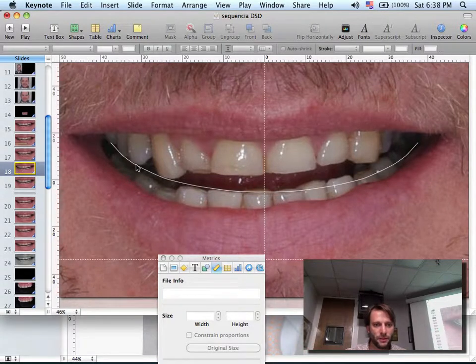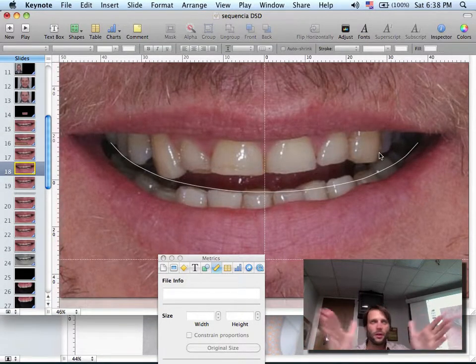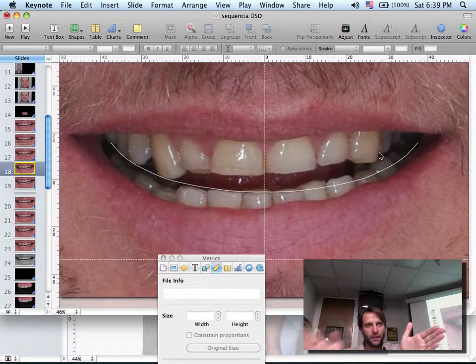So I will see the relation between the line, and I will guide my bicuspids and molars. Just the buccal. Meaning now I'm determining the smile line, the whole smile line and the buccal corridor. The picture of the smile will show me how much I need to fill in. So I'm always going back, each step, to the photos. The technician should do that. The face photo will show me if I need to fill in, add more wax on one side, less on the other. Smile line and buccal corridor are finished with the 4th step.